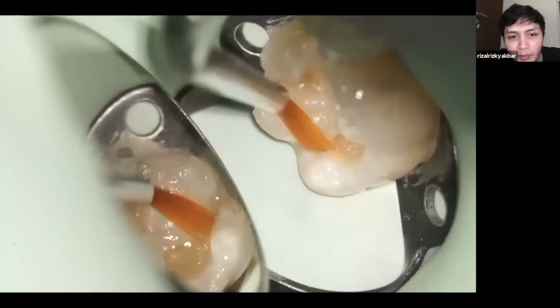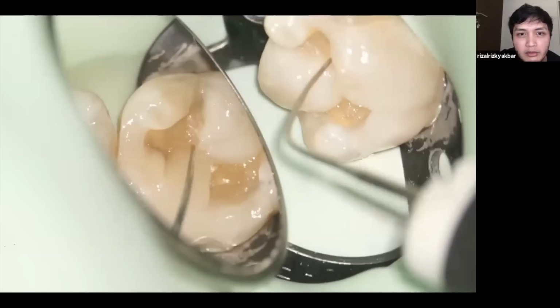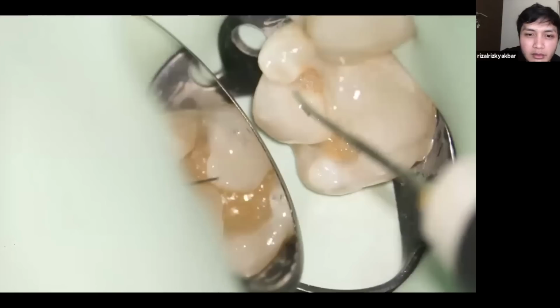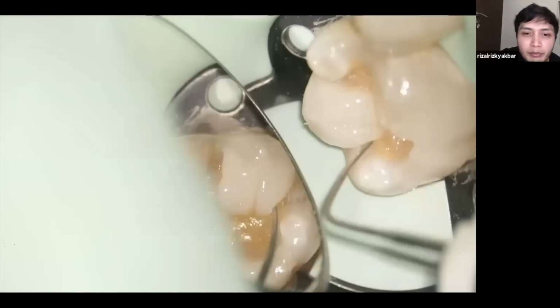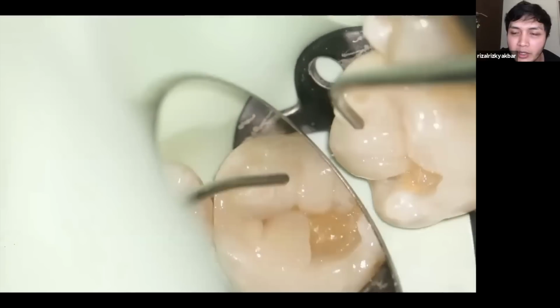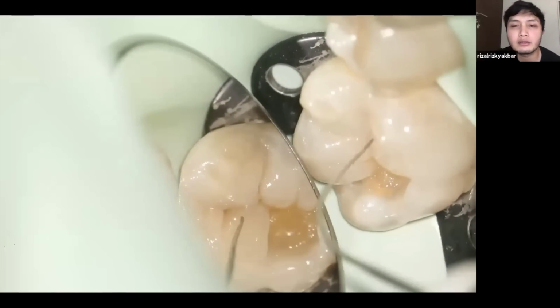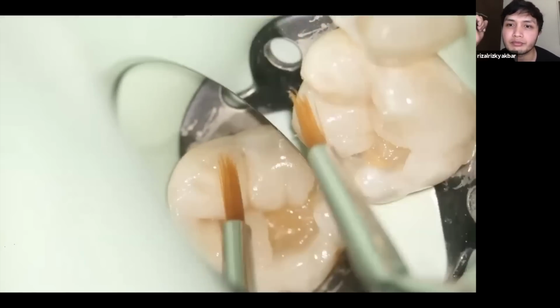So like I said before, incremental layering, cusp by cusp technique. This is a first lower molar, so there will be 5 cusps to make. I really like to make it diagonally. So after I've done with the buccal cusps, I go to the lingual cusps, distal lingual cusps, and then I go back to the mesial lingual.